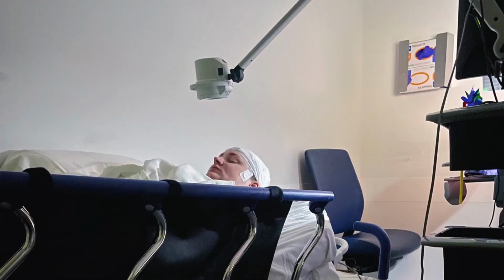And the first thing I had to do was lay down in the bed, and then they put this little, almost like camera looking thing directly over me, and it flashed lights at me with my eyes closed for 3 minutes straight. And let me tell you, that was an experience. It was so weird. After that, they had me go ahead and close my eyes again and hyperventilate through my mouth because oftentimes hyperventilating can trigger a seizure, and I had to do that for 3 minutes. And let me tell you, I was so lightheaded and dizzy afterwards, so I was pretty thankful that I was already laying down. And then lastly, I had to sleep for 20 to 25 minutes.